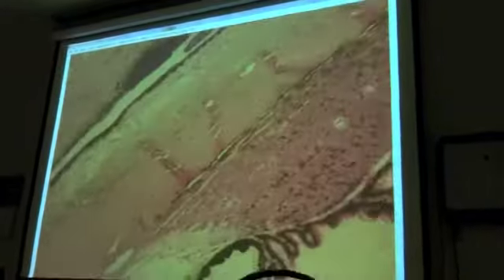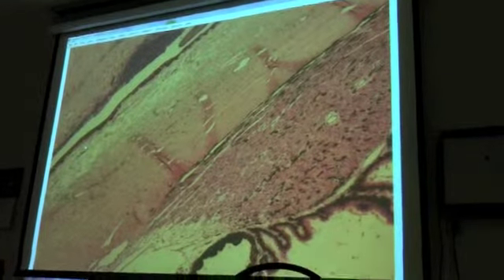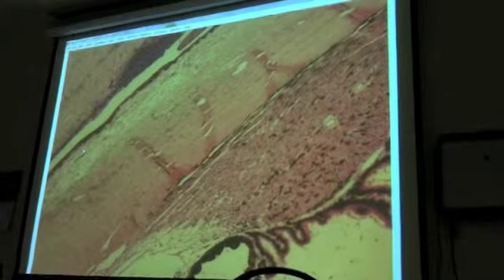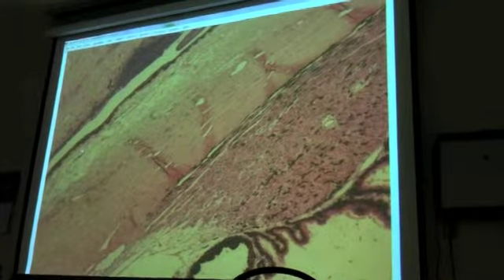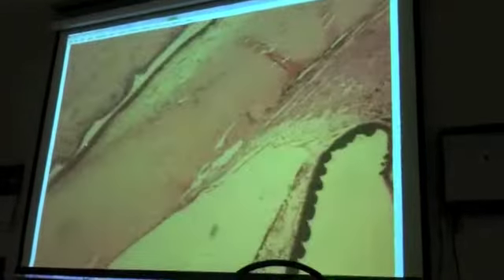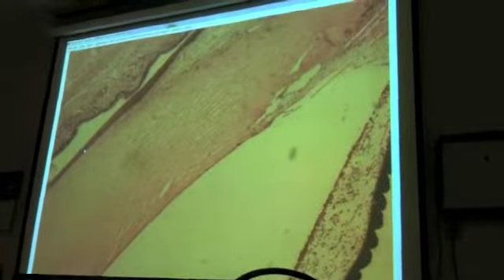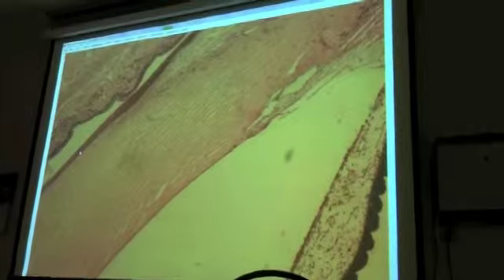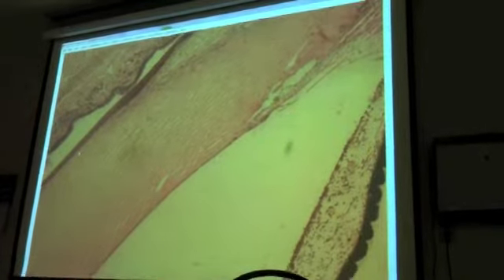And we come forward of that, and here, if we came up from the side, here's the ciliary body, and here's the sclera, the fibrous connective tissue. As we follow the sclera anteriorly, it gets organized and becomes transparent and bows out with a different curvature in front of the lens.